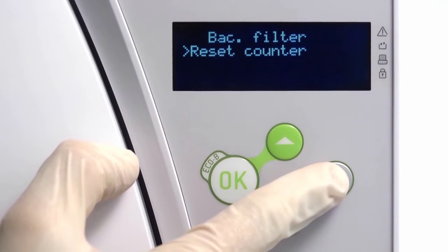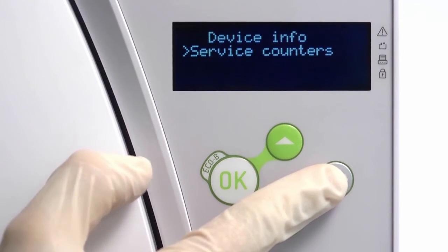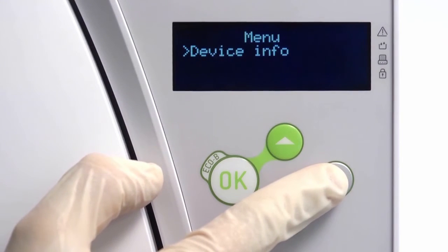Now, navigate back to the cycle selection screen to return your Liener steriliser ready for normal operation.